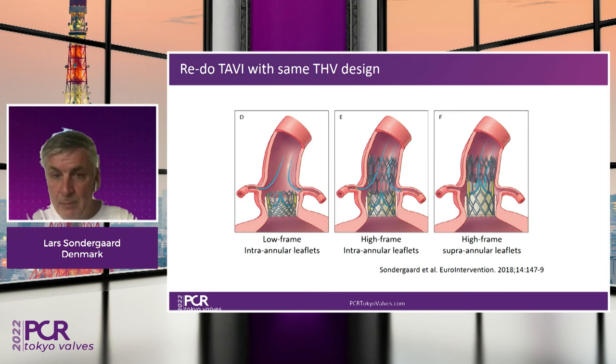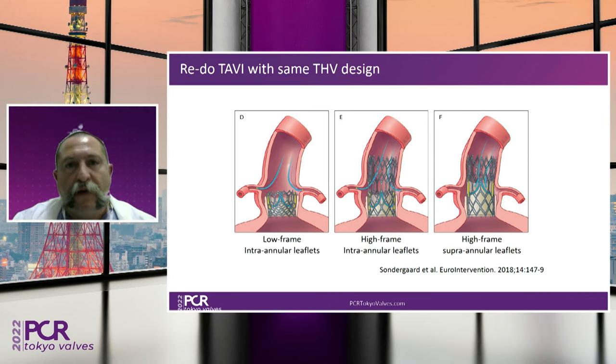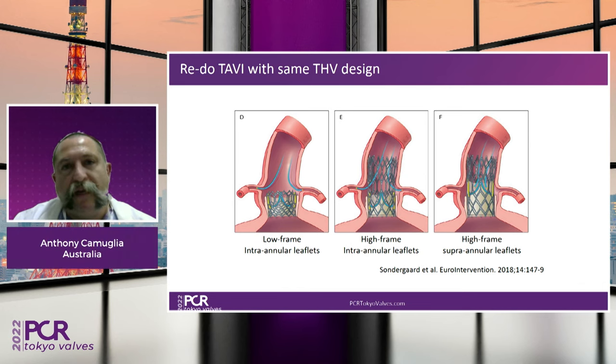And maybe you can address some of the issues we're seeing with redo TAVI, Anthony, because there are some things we need to take into consideration. Yeah, this is going to be a growing area, I think, as we move toward patients who are living out their valves. And the American data was pretty sobering of where we're heading. The lifetime journey approach is a good conceptualization to communicate with each other and in heart teams about how we think about these patients.